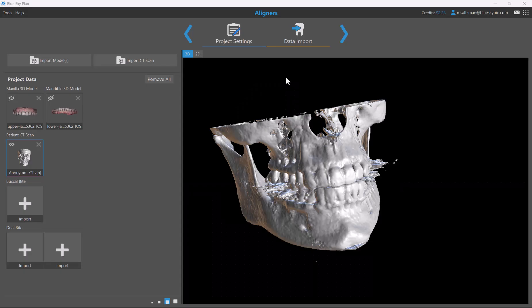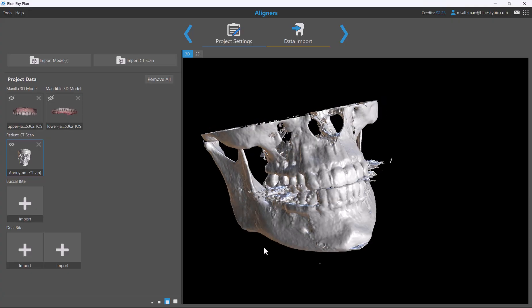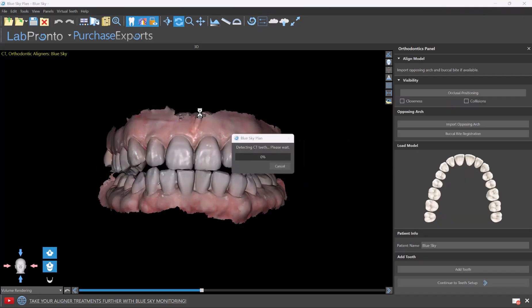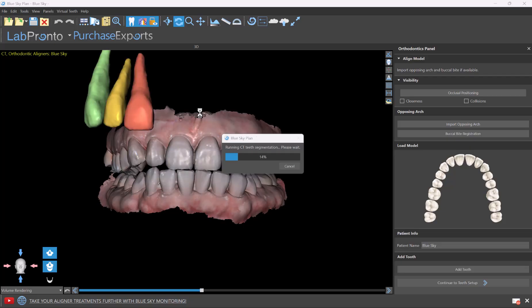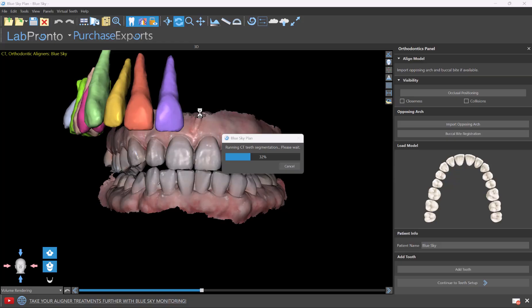Next is completely automatic CT segmentation. We completely automatically segment each individual tooth and each jaw, and we align it automatically to the optical scans. We show the full anatomy of each individual tooth, and that's automatic with a single click. I'm going to click the next button and we'll see what happens.